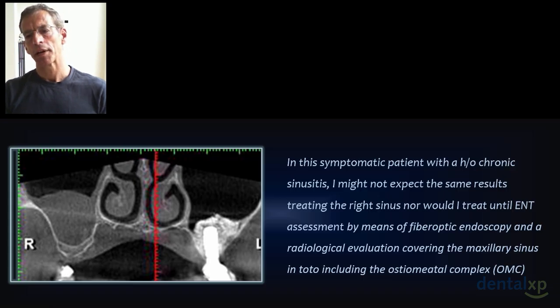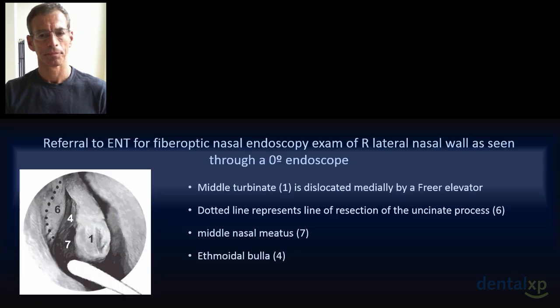In this symptomatic patient with a history of chronic sinusitis, I might not expect the same results treating the right sinus that I achieved with the left, nor would I treat this right sinus until the ENT assessed this patient with an endoscopic exam, as well as a radiologic evaluation of the osteomeatal complex.